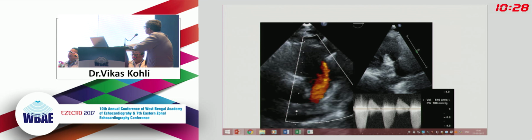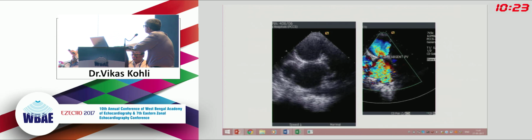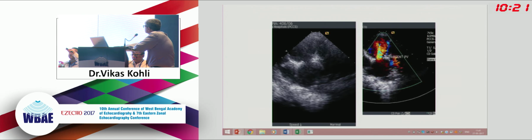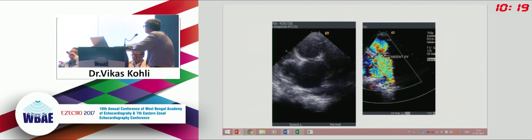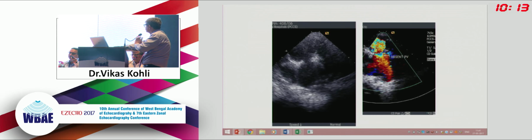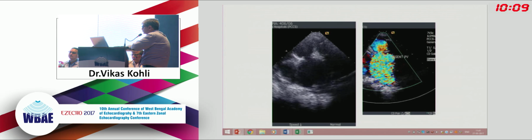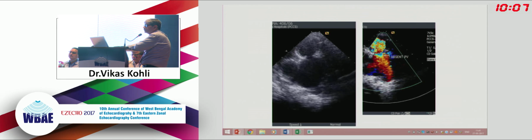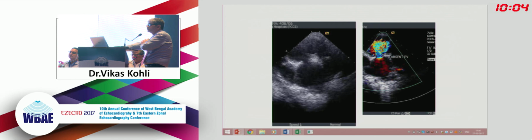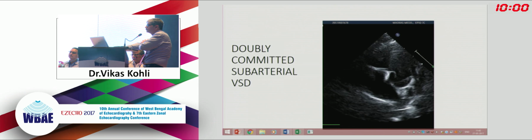because of the obstruction of the bronchioles. Another example, again absent pulmonary valve, and you can see one point obstruction where we are getting free pulmonary regurgitation along with significant obstruction. So pulmonary arteries are dilated in these cases, and so these patients require reduction pulmonary arterioplasty, as Dr. Amitabh was mentioning, because of the aneurysmally dilated PA. So we need to tell surgeons how big and all the details. So this variant is another interesting variant of tetralogy.